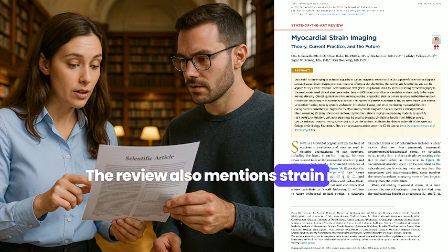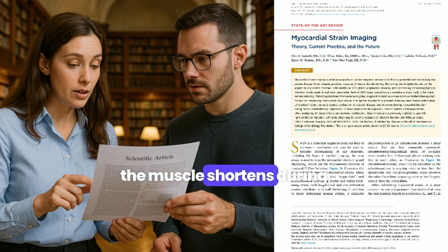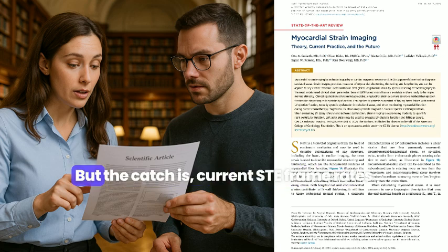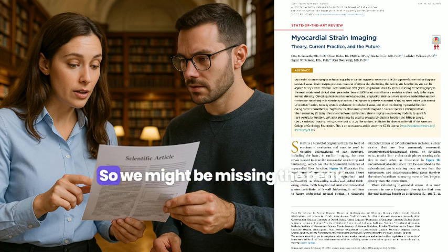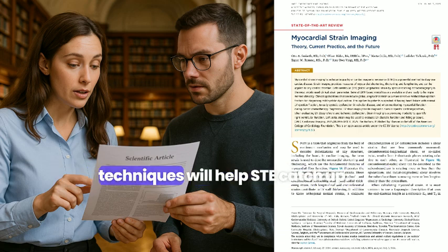The review also mentions strain rate. Is this something we should focus on more? The speed of deformation? It's an interesting idea. Peak systolic strain rate, how fast the muscle shortens during contraction, might actually be a better indicator of pure contractility. Why is that? It seems less affected by loading conditions, preload and afterload, and maybe chamber size compared to peak strain itself. But the catch is, current STE frame rates might not capture the absolute fastest strain rates, which happen really quickly during those isovolumic bits. So we might be missing the peak. Potentially. Tissue Doppler actually has better temporal resolution for that, and maybe these new high frame rate echo techniques will help STE catch up. It's an area to watch.